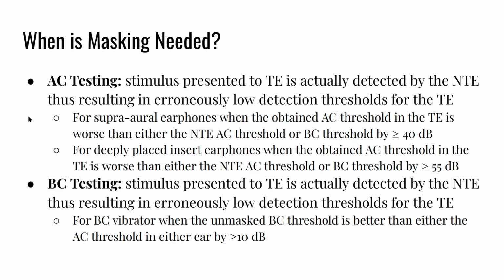But for a deeply placed insert earphone, when we obtain the air conduction threshold in the test ear, if that's worse than either the non-test ear air conduction threshold or bone conduction threshold by at least 55 dB, that's when we need to mask in that situation.